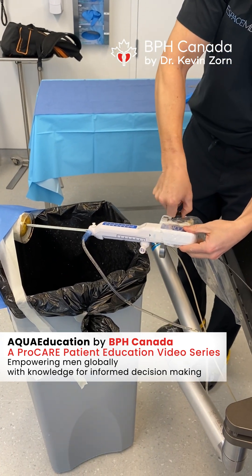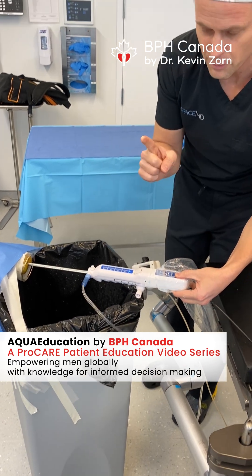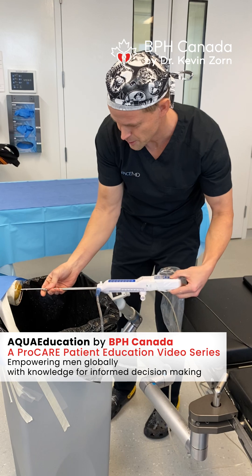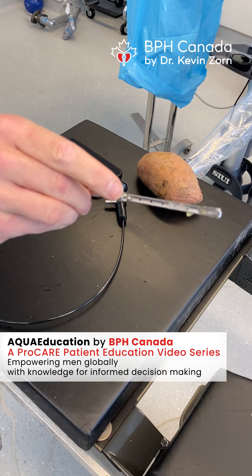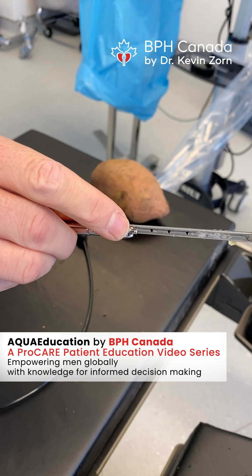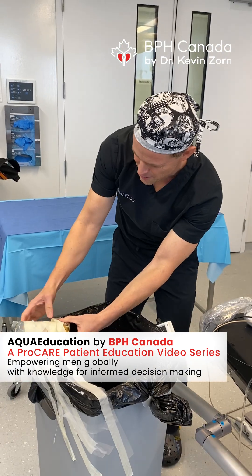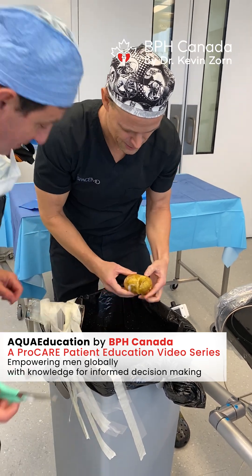To unlock, we'll unlock our magnet. The handpiece — this is a single-use handpiece, used for one person. It's not used between other people; it's not like laser fibers that sometimes get reused between patients. I'll go ahead and pull out. Here's our handpiece — that little tip right at the end of my finger is the sapphire opening that the high-pressure water comes through. Maybe we'll do a video after and show you what that looks like. Dr. Zell, my colleague here — the best anesthesia around.